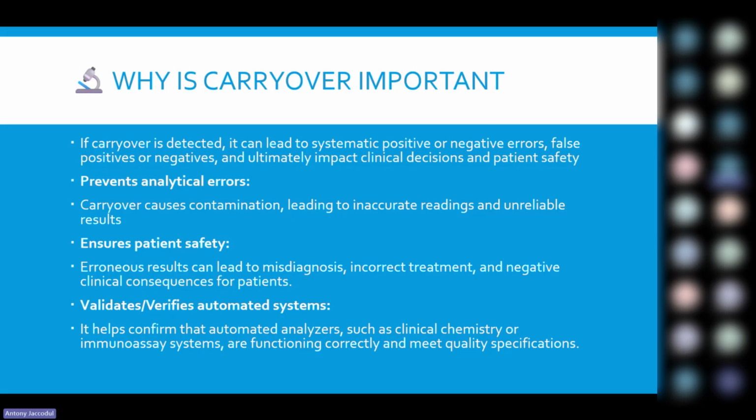Carryover testing is also used in verification and validation of automated test systems. It helps confirm that automated analyzers, such as clinical chemistry, immunoassays, or hematology, are functioning correctly and are meeting specifications as per the manufacturer claims. So it's an important aspect in eliminating analytical errors, ensuring patient safety, and also ensuring that verification of these automated systems is top-notch.